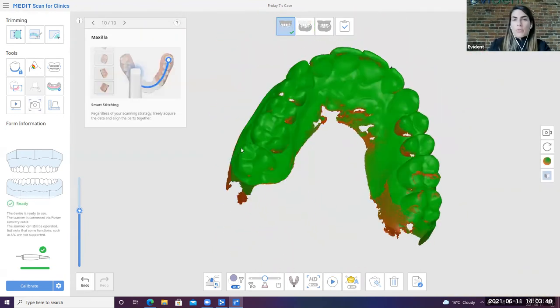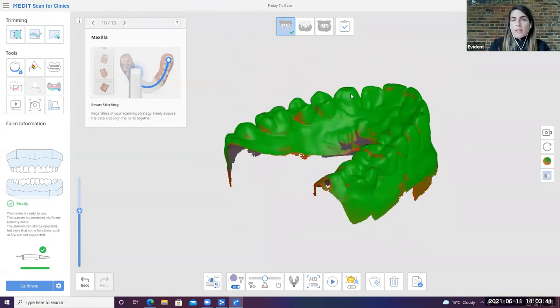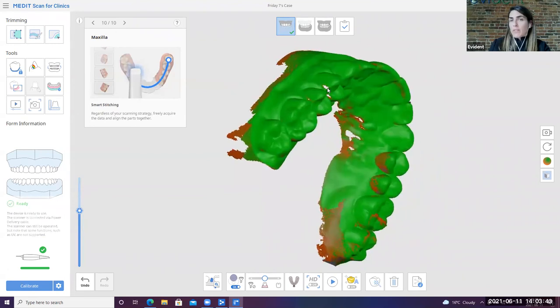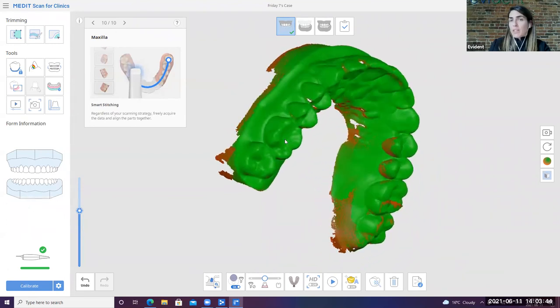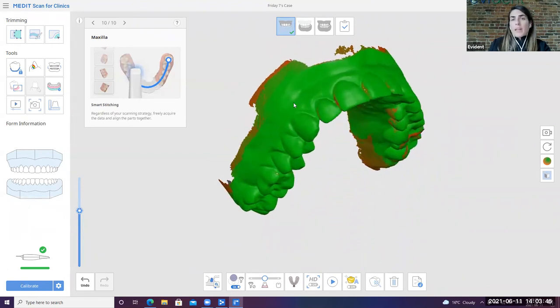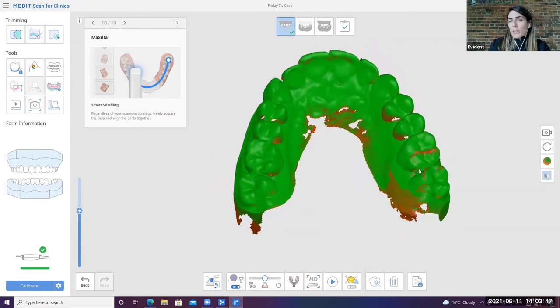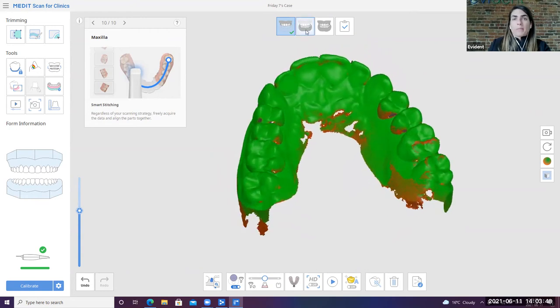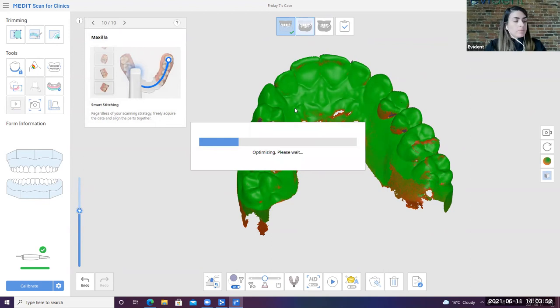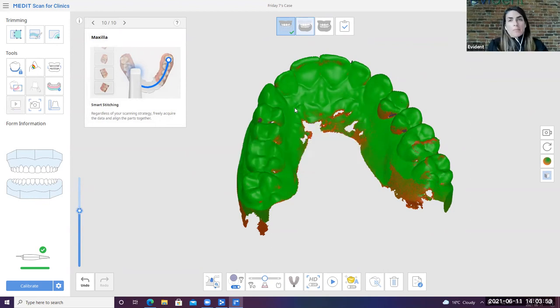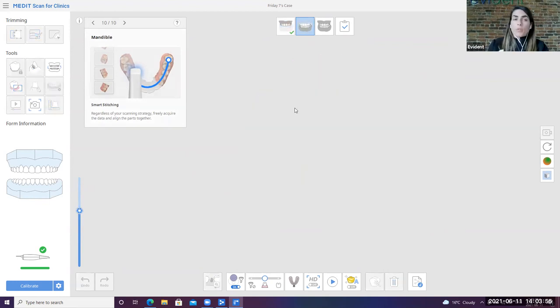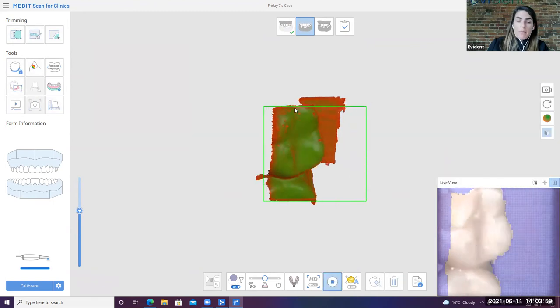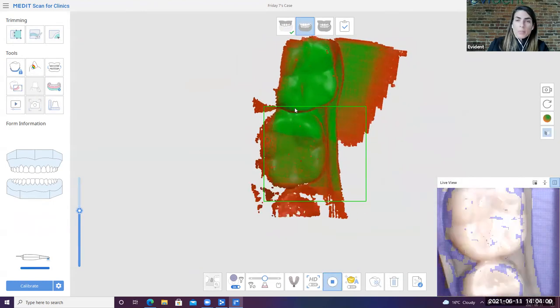So it should be good to go with that data. So like I said, I do realize I've been missing data here, but that isn't going to be affecting what we need to do. So we're going to go ahead to the lower. And I'm going to do the same. I'm going to do a walking motion to collect my mountaintops and then move to the buccal.